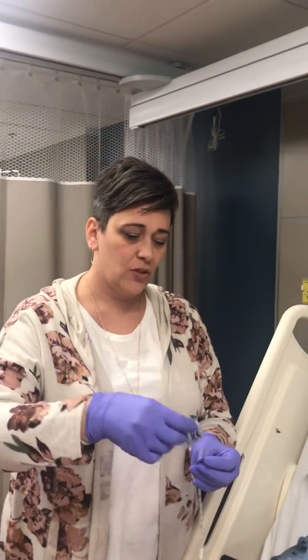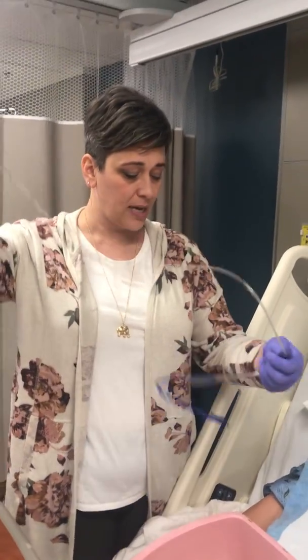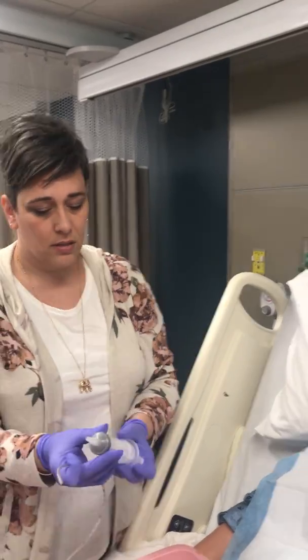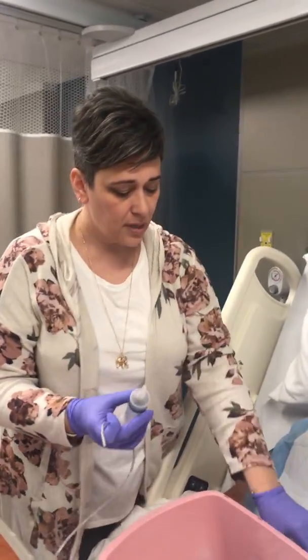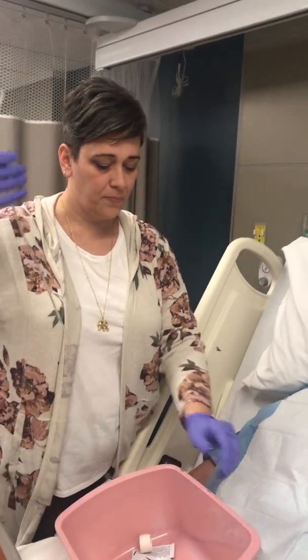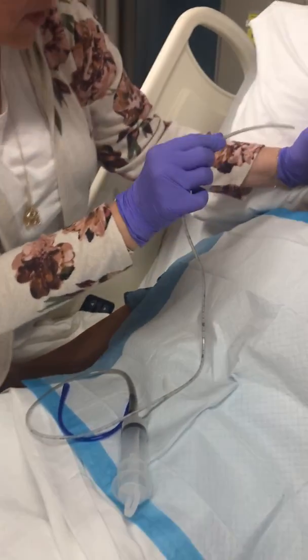I'm going to lubricate my tube two to four inches. The patient is in high Fowler's, as high as the bed goes up. The bed is raised so I can see more easily what I'm doing. I'll move the basin just for now so you can see. Okay, lubed. I have the patient looking — I'm going to go straight in.